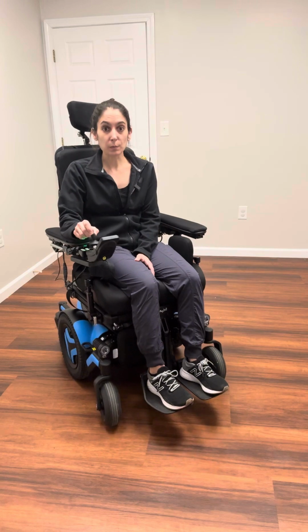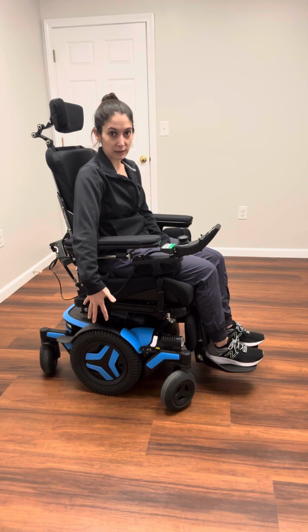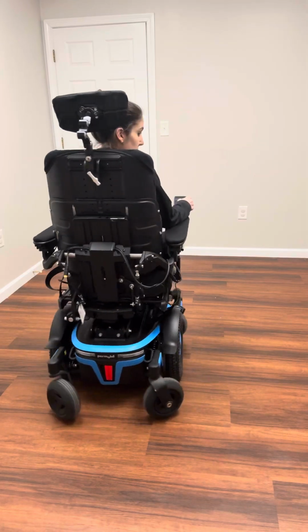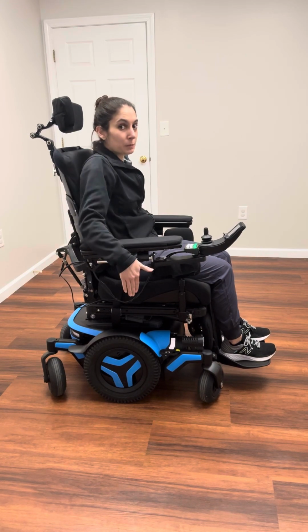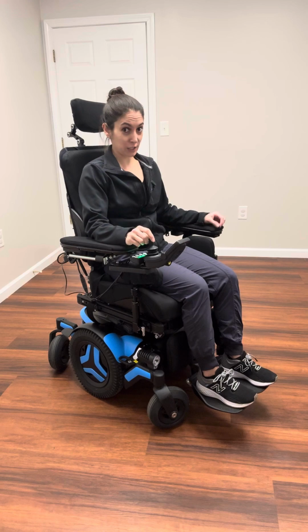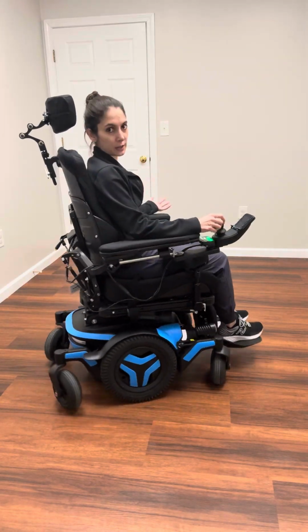So for one thing, for a mid-wheel drive chair, or really for all the drive systems, when the chair turns, that pivot point is where the big wheel is. So in this chair, if I turn, that pivot point is that middle wheel, okay? Some of the chair is in front of me turning, some of it's behind me turning, but the middle is the pivot point. Of all the 3 drive systems, mid-wheel drive has the tightest turning radius. So if you are in one spot and you are literally just turning in a circle like this, then mid-wheel drive takes up the least amount of area.